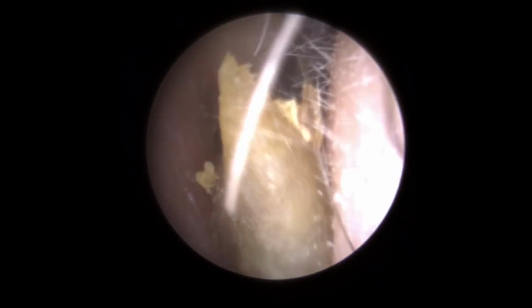The gap at the top right is too small to fit the Jobson horn through, and we've kind of lost our ledge now, so we've got nothing to pull against. So I'm aiming there, just got it into that gap just there, and if we pull down now we can get that bend behind the wax. Watch what happens, because we can use the tool the right way. It pulls this wax, slides it forward. There we are.